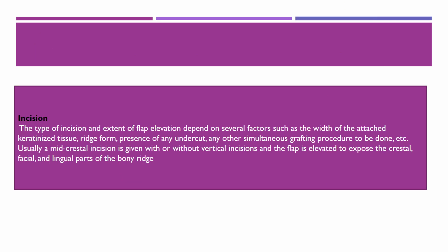So coming to the surgical part, incision. The type of incision and the extent of flap elevation depend on several factors: the width of attached gingiva, keratinized tissue, ridge form, presence of undercut, or any simultaneous grafting procedure to be done, etc. Usually a mid-crestal incision is given with or without vertical incision.